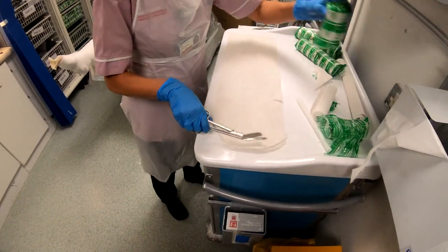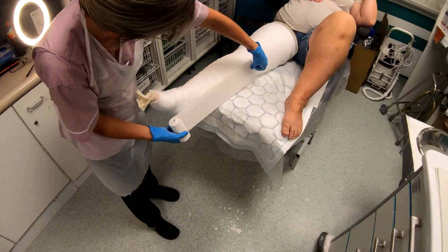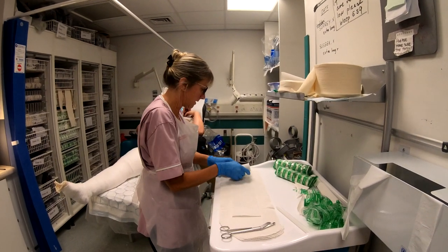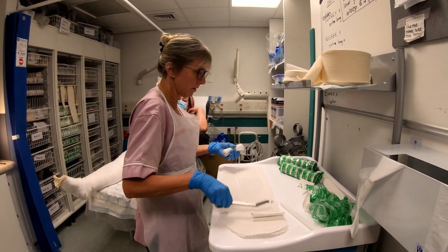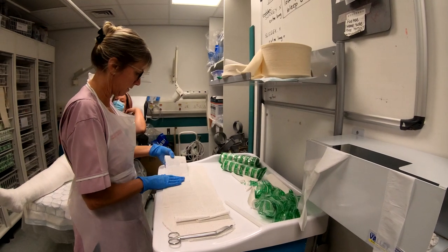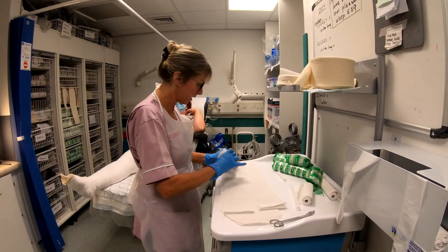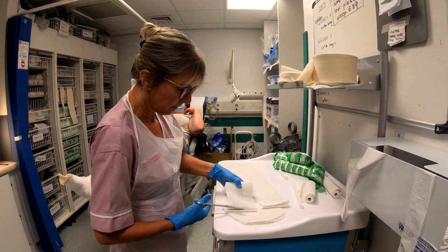Now we need the stirrups. We're going to use the 10-centimeter plaster. We need two lots of four layers, so just tuck it around the heel to measure how long we need. Four layers for one stirrup, and we need two lots of them. So we're continuing on doing our stirrups — we've done one lot of four, and we're in the middle of doing our next lot of four. That gives us the two stirrups for the below knee.